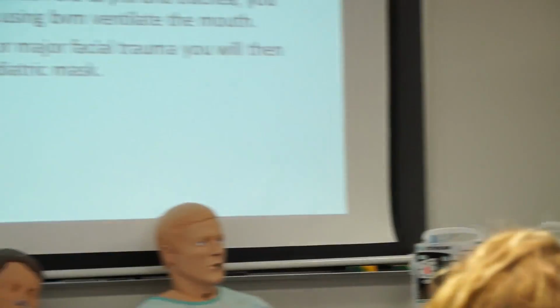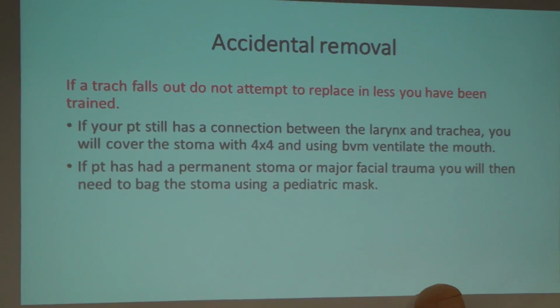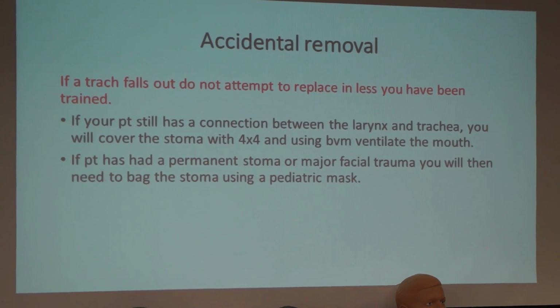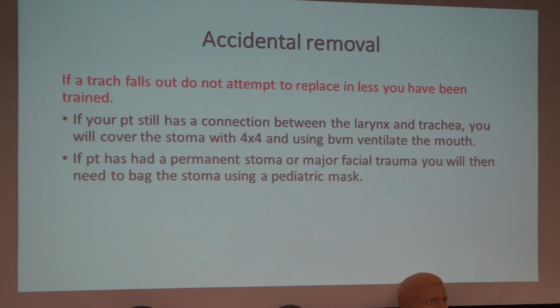So you see that I put it in red here. If the trach falls out, do not attempt to put it back in unless you're trained. Okay? You can cause a lot more damage to your patient by putting that trach back in if you're not trained on how to do it. Unless that patient's had that trach in for 2 or 3 years, there's going to be really nice granulation of tissue around the stoma site, and you can easily put it in.